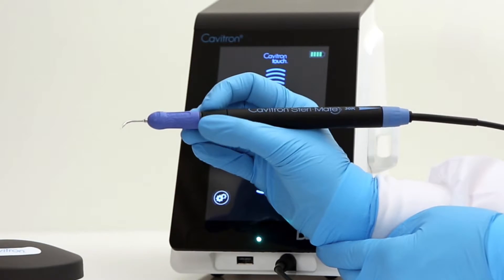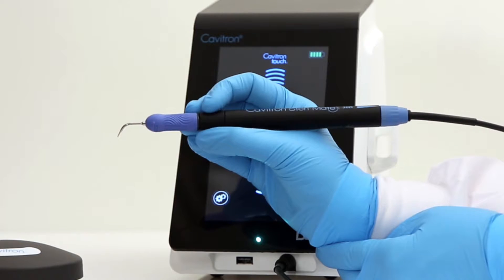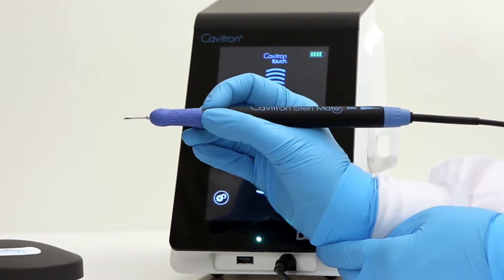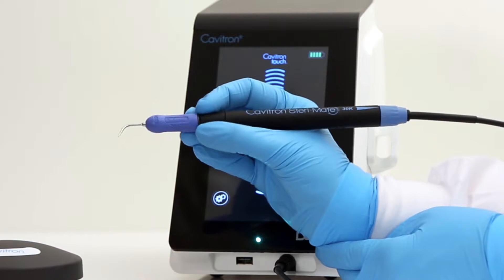The SteriMate 360 provides the clinician with access within the entire oral cavity. To rotate the ultrasonic insert, place fingers on the nose of the handpiece and rotate to your desired position.